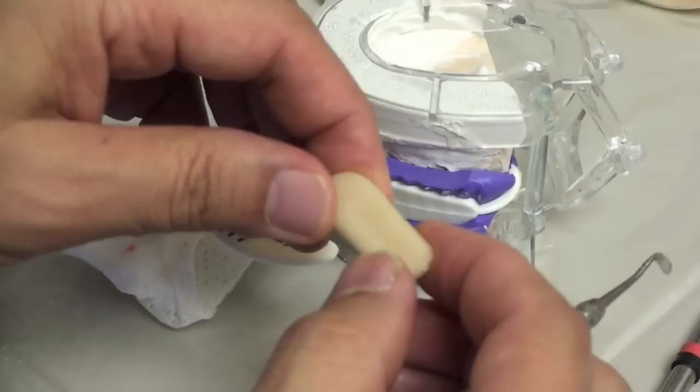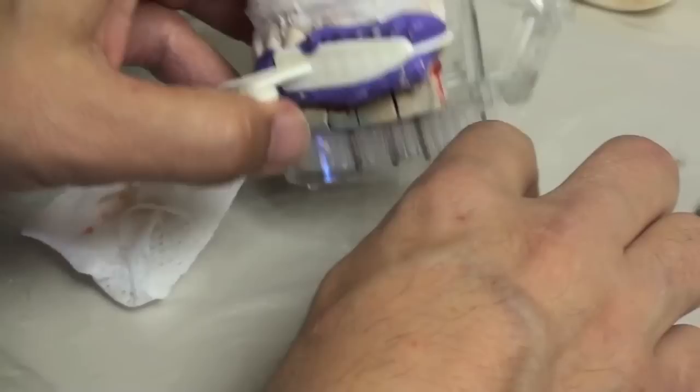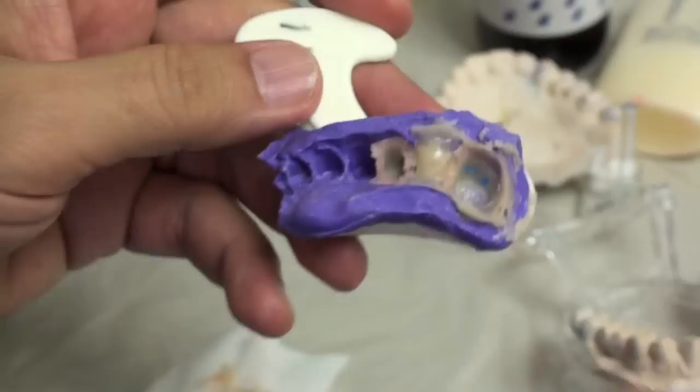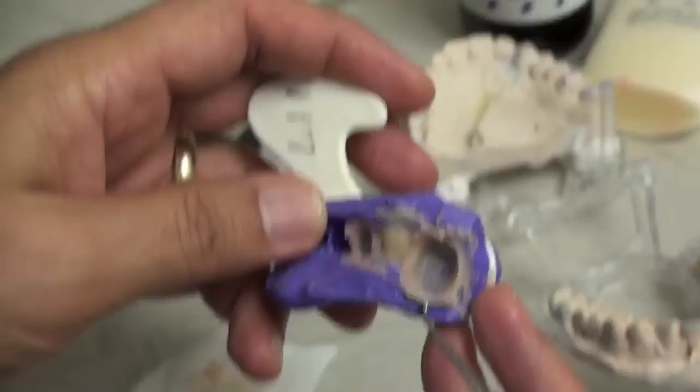Now it's definitely starting to get some warmth here. It's still distorting though — just about right. It's starting to feel that heat; you don't want to reach in the patient's mouth too long because it will chemically burn. I have a big void in here where I didn't place enough material. Sometimes we'll go through the reline process too. This is rubbery, but if I tried to take it out now it would distort big time. So I'm going to let this cure all the way and then we're going to do a reline — I'll show you how we do the reline.